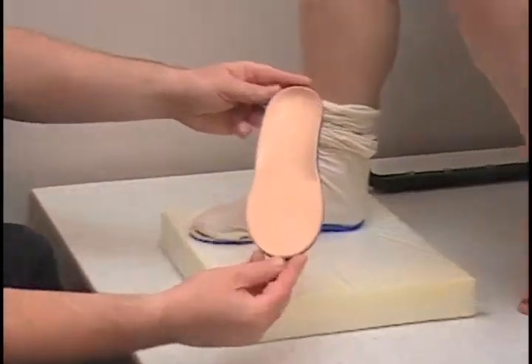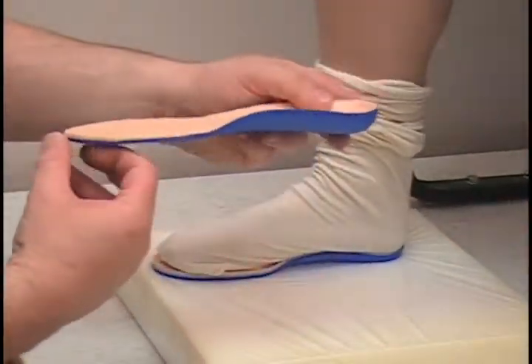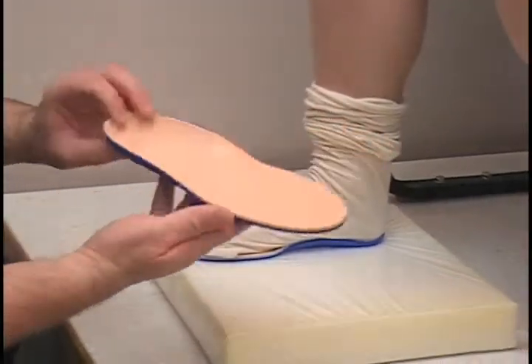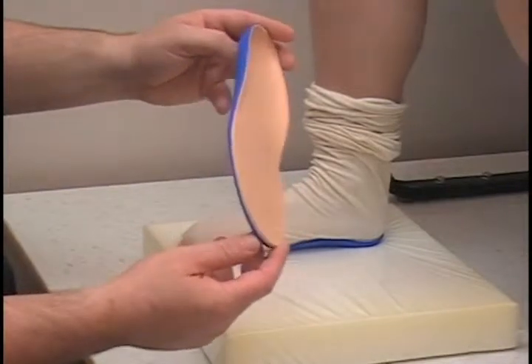This is the finished product, and as you can see it's changed to the shape of her foot — the arch is encapsulated there, changed a little bit on the lateral side. So this is a custom formed foot orthotic.